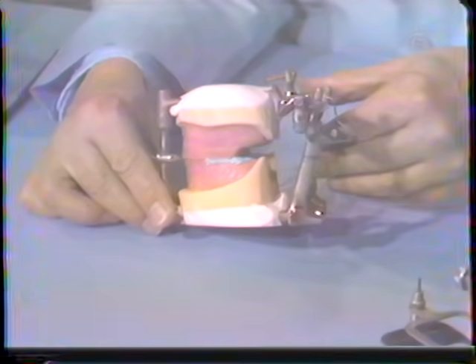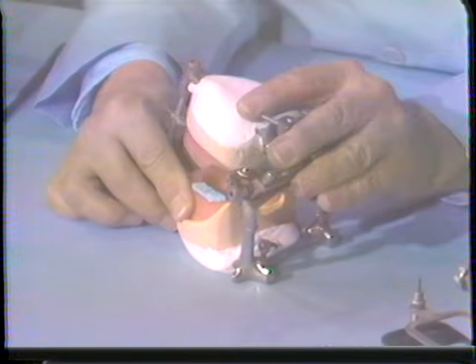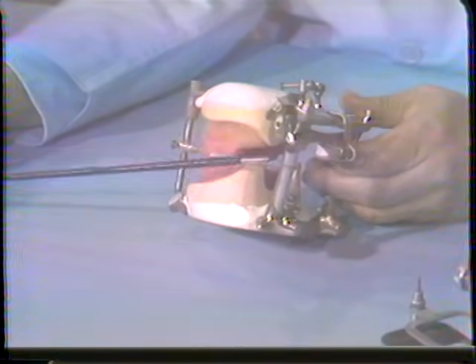It had been used for many years. Dr. Gysi in 1929 talked a great deal at various meetings about this instrument, because in the research that he had done, he found out that the number of patients, the majority, about 50%, or a bit more, had a 30-degree inclination of the condyle path in the fossa.